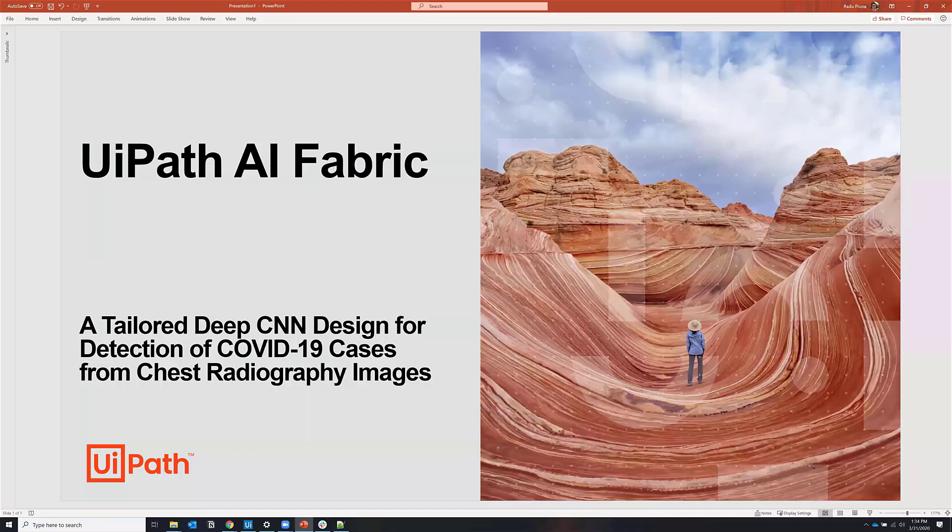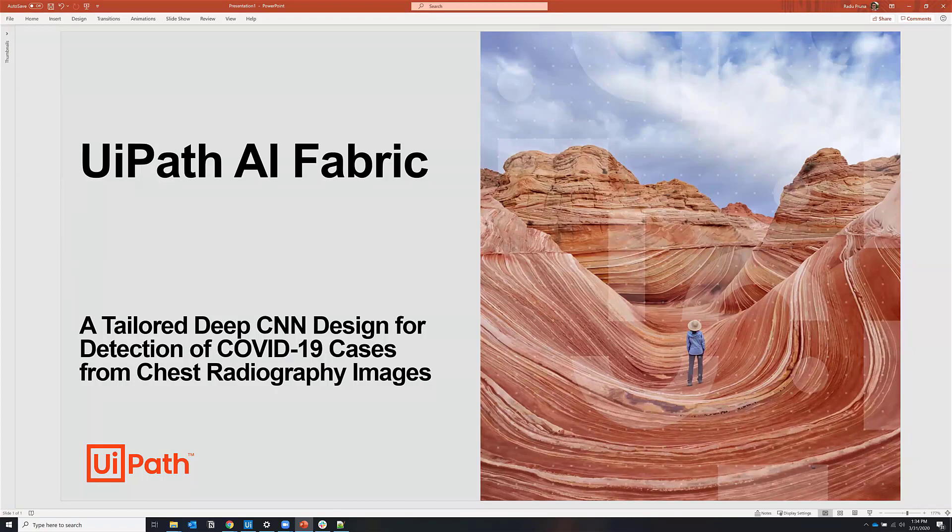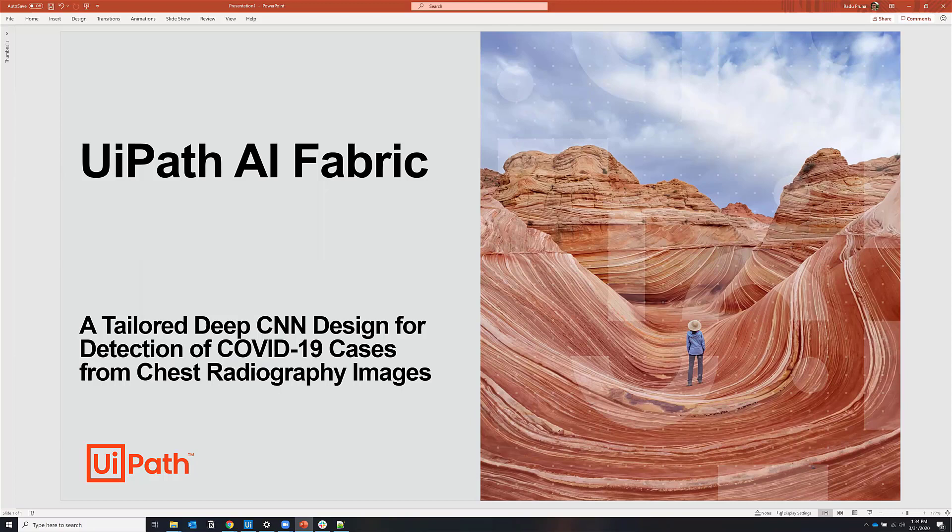In this short video, I'm going to demonstrate how you can use UiPath's AI Fabric to deploy a deep convolutional neural network designed to detect COVID-19 cases using chest x-ray images.